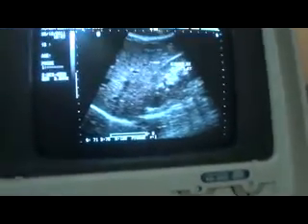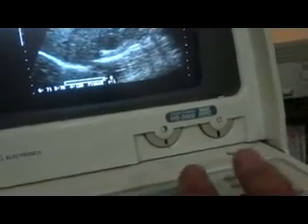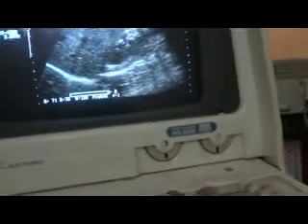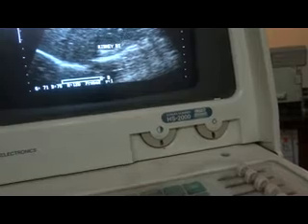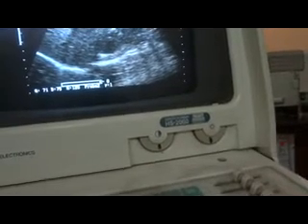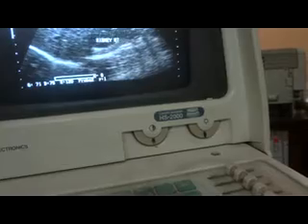We were studying the comparison of echogenicity of the liver with that of the right kidney. This is the right kidney. And this is the liver.